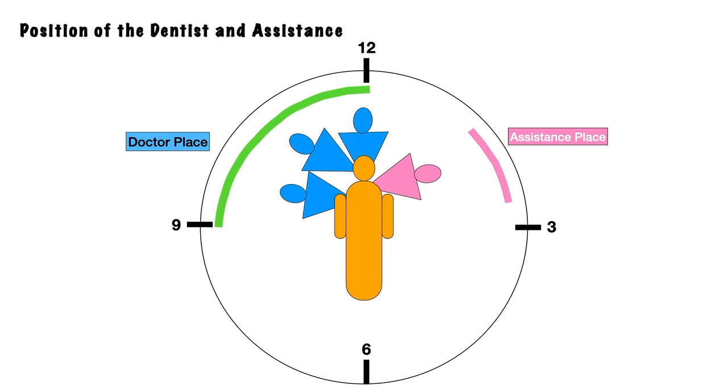For me, mostly I am sitting between 9 and 10, 9 and 10. In some rare cases, I have a 12 o'clock position. But it is important for the people who are beginning to use it, who are not able to control the case, so they're asking this question. So it's an important slide, but it doesn't have too much information.